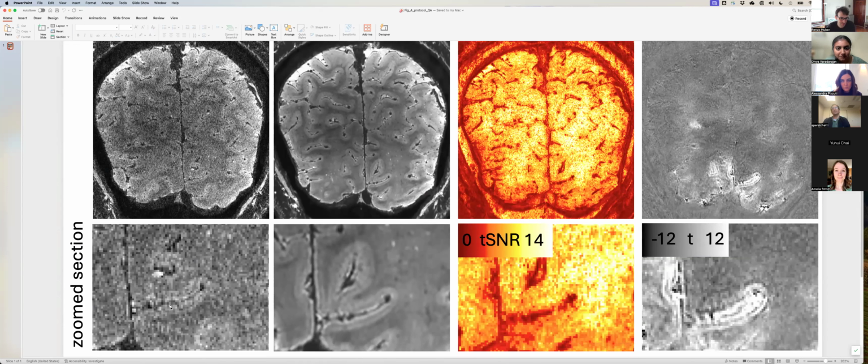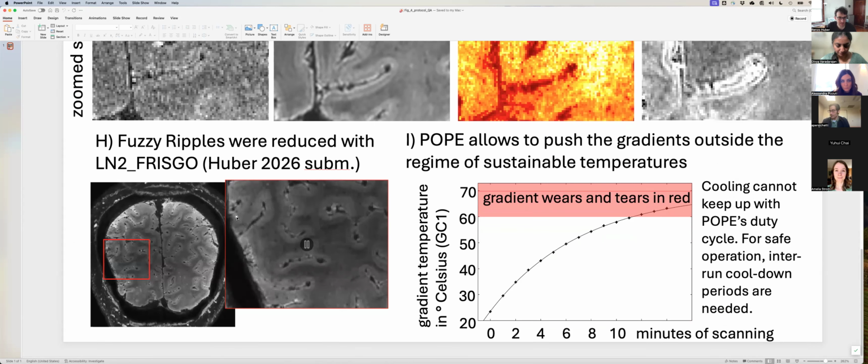And you do see indications of the mesoscale features, like the different layers over here, or maybe indications of the vessels coming in. Our tSNR is just barely double digit, which is my threshold for checkerboard experiments, so you can detect activations with these fine scale features of positive, negative activities, and also these individual stripes over there. We run this with LN2 and also unplugging the third of the shim. Otherwise, we might have a tiny little bit of artifacts to some degree.